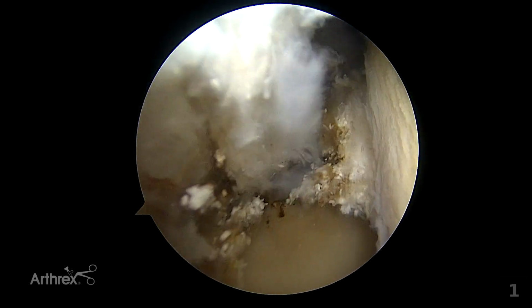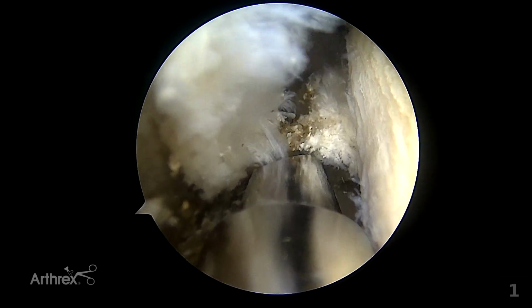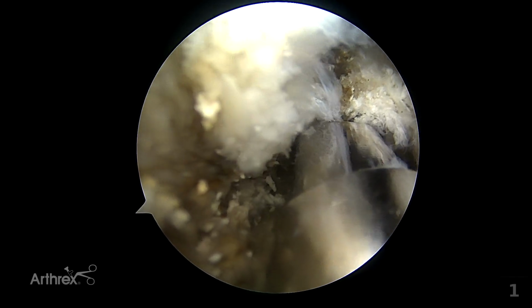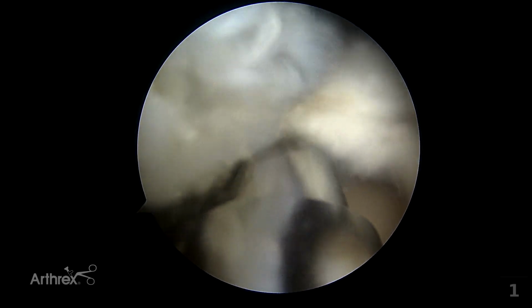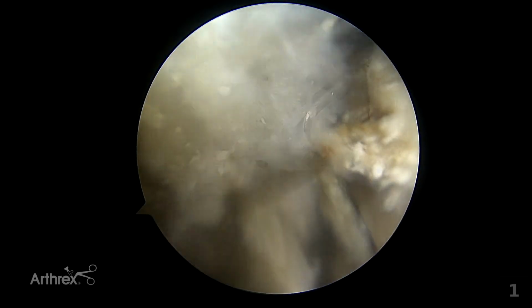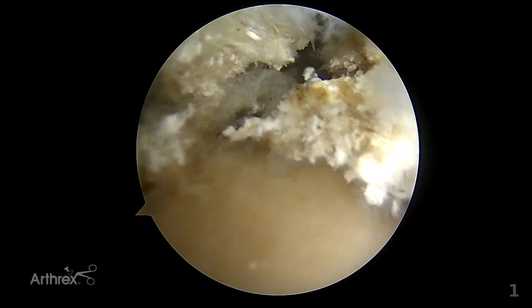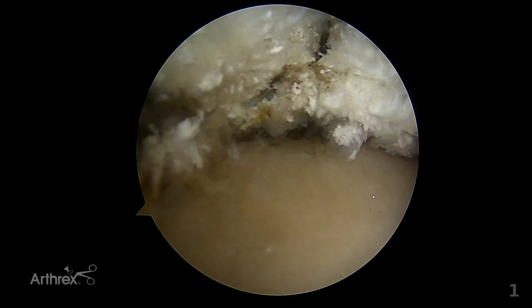So we'll take this in through the medial portal again. We just raise our hand up, and we can take off that plateau osteophyte that often happens there in chronic root tears and just burr that down. So here we've just successfully burred it off right there in the corner. It was right here. But you wouldn't want to put the meniscus right back down to an osteophyte. So you'd want to burr it off.